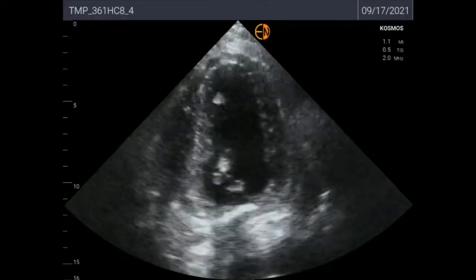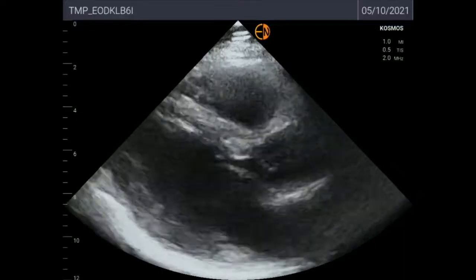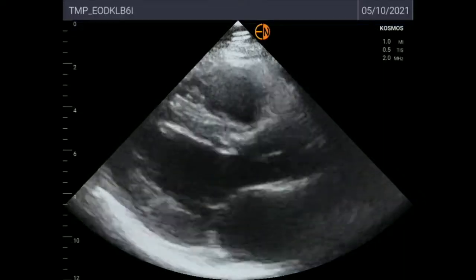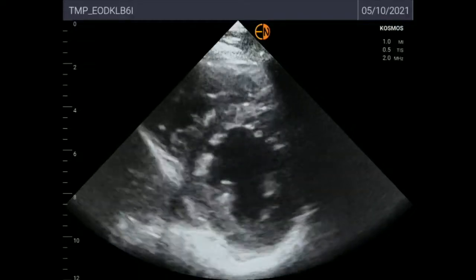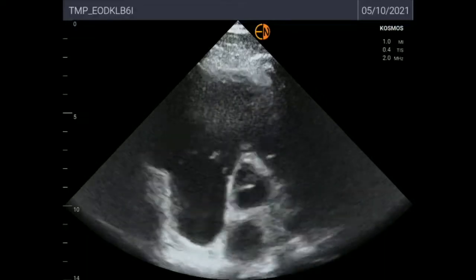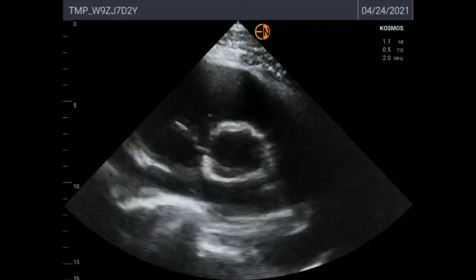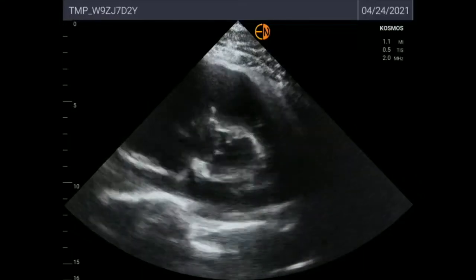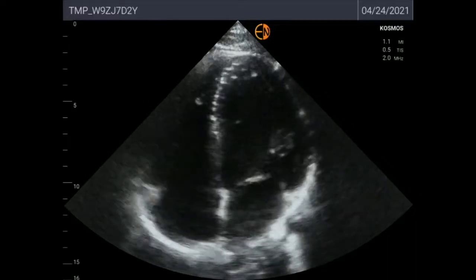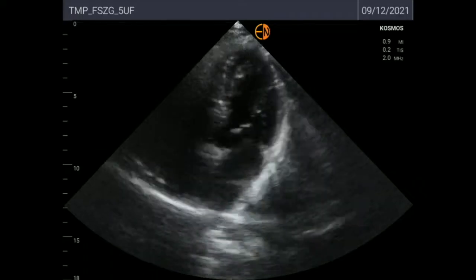This is an apical 4-chamber of a patient with severe hypokinesis — you can see that myocardial contractility is severely impaired. And this is another patient with a parasternal long axis, followed by a parasternal short axis of the same patient; the image quality is very good due to a good echocardiographic window. This is a high parasternal short axis of the aortic valve, and then another one from a different patient so you can see the differences between different echo windows. Now you'll see two different apical 4-chamber clips of random patients.